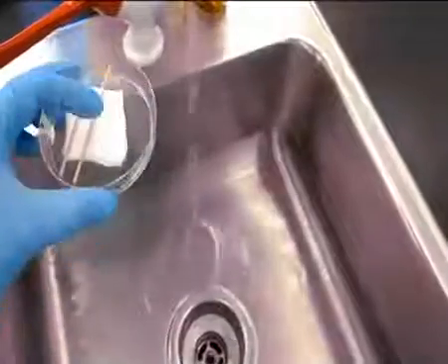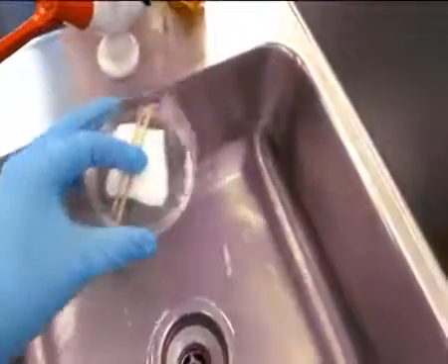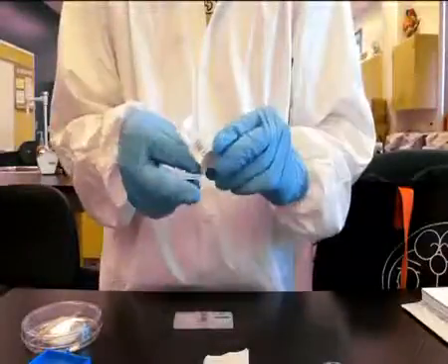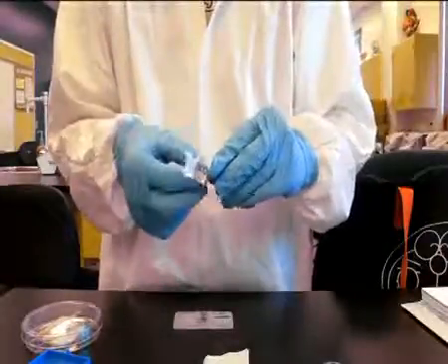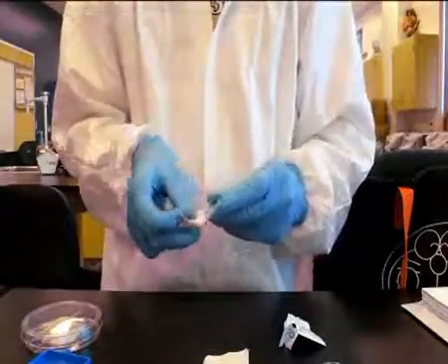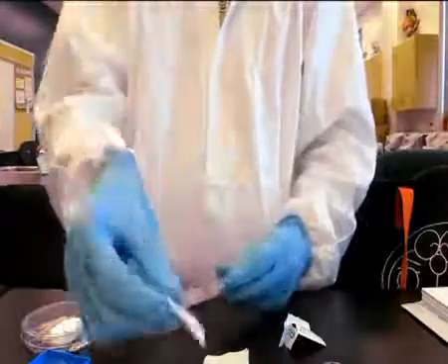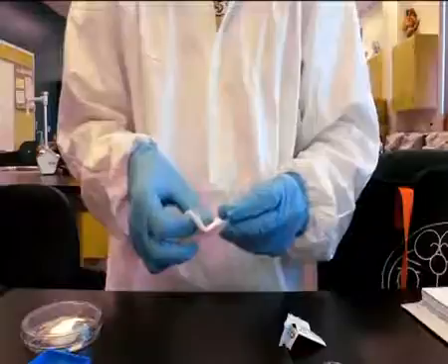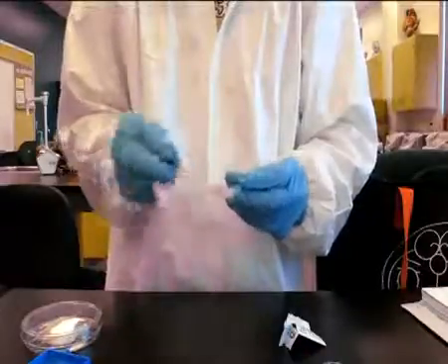Wet the gauze in the humidity chamber by placing a few drops of water on it. The hemocytometer and the cover glass should be cleaned first using an alcohol swab. It should be dried using only a cotton gauze; otherwise the glass will get scratched.